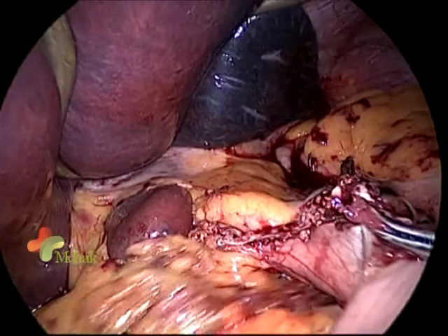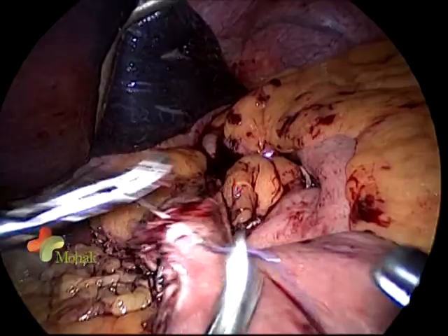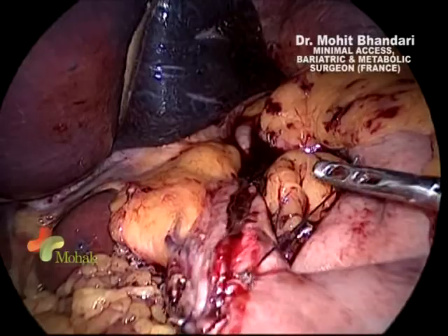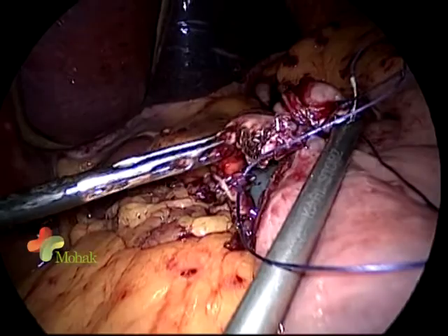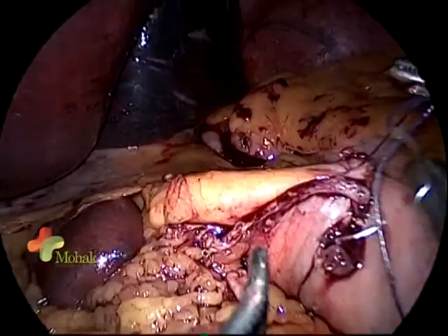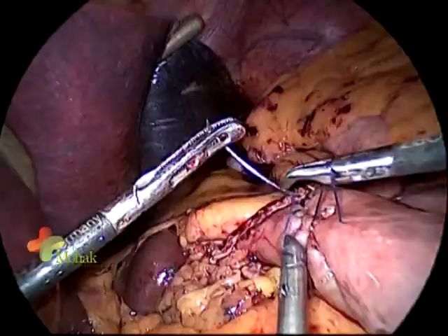Once the bougie is crossed, we repair the gastrojejunostomy. Following the same principle used in all our bypasses, we take the first layer with Vicryl 2-0, burying as much mucosa as possible, with a second layer of silk in all cases. The gastric calibration tube may exert some pressure initially, but it is a safe technique as we do not take the posterior layer. These patients will not have stomal stenosis or dysphagia later because we have properly calibrated that area.